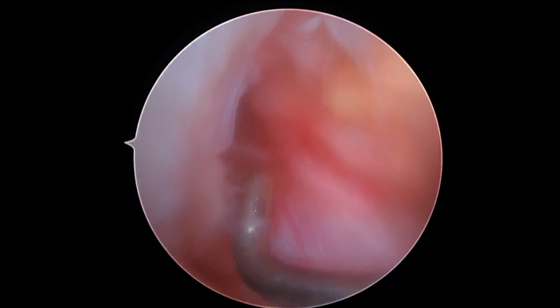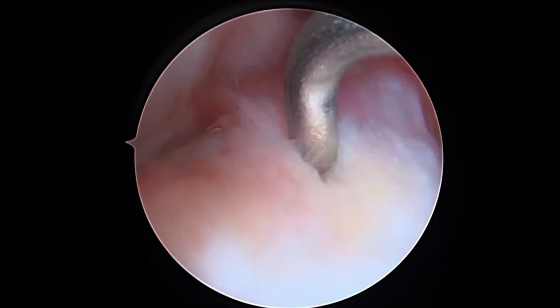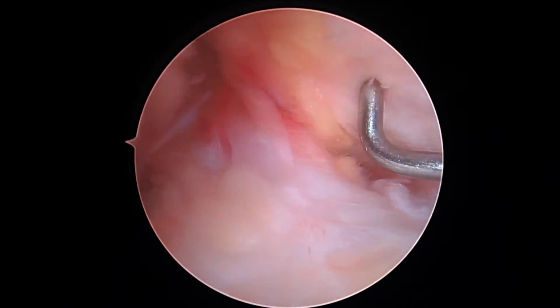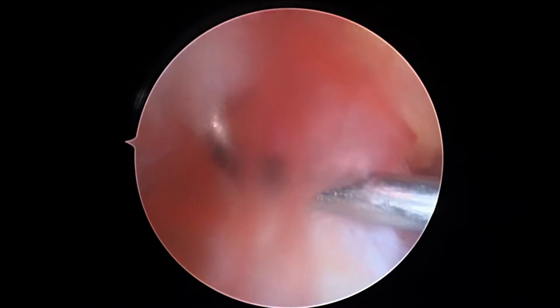This is the anterior cruciate ligament here. Your knee was stable when we examined it under anesthesia, so this ACL is working pretty well for you. Behind this is the posterior cruciate ligament attachment, and this is where the ACL is back through here.